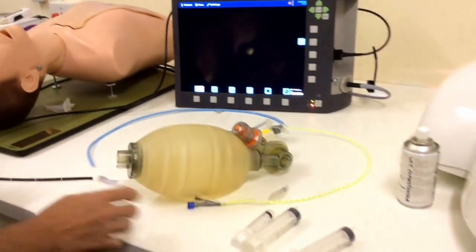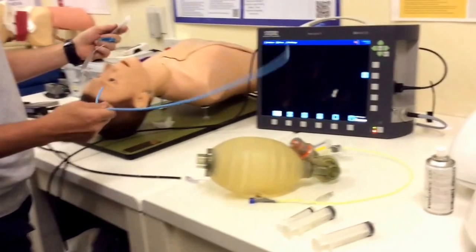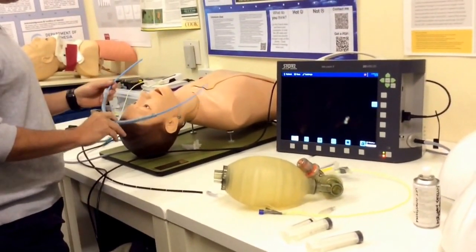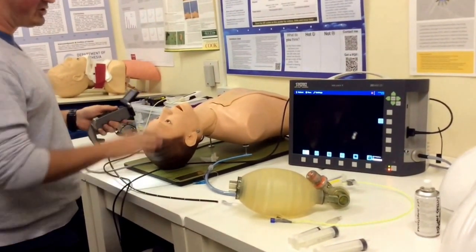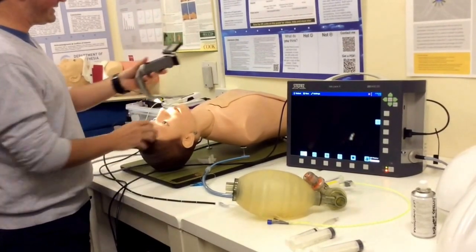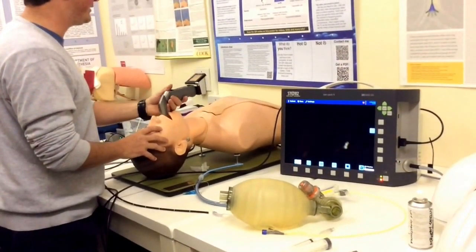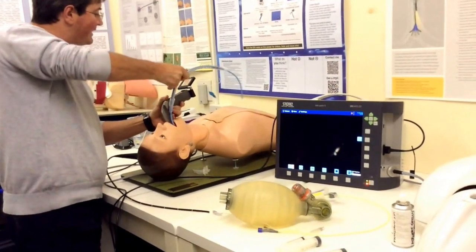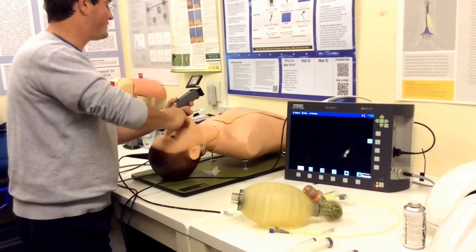One of the nice things about using a bronchial blocker is that if you've got a patient with more difficult airway anatomy where you'd struggle with a double lumen tube, you can use a single lumen tube with a blocker with a relative amount of ease. This patient has a tricky airway. I'm going to use my video laryngoscope to get a grade 2 view, place my introducer, and the tube is in.